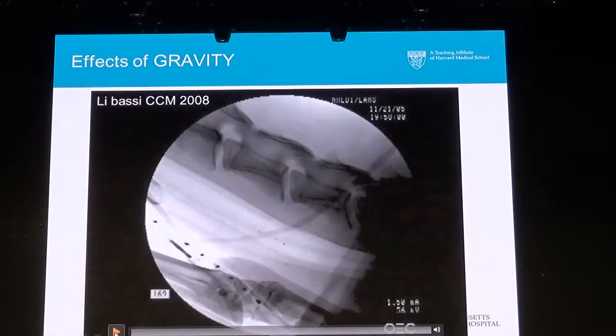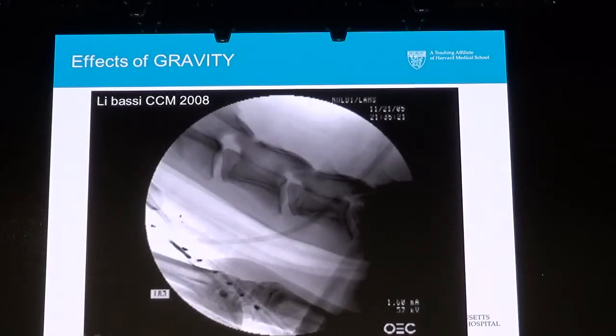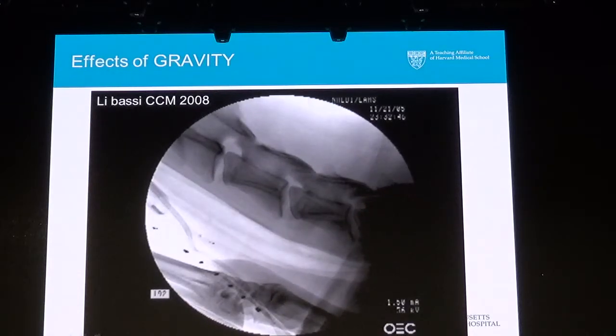What you see here are nitinol spheres that come all the way up close to the endotracheal tube tip, and then go down towards the lungs. It is just the mucociliary clearance of secretions that come all the way up, but of course they cannot get out of the airways because of the presence of the endotracheal tube.